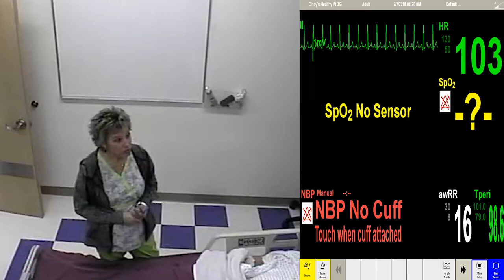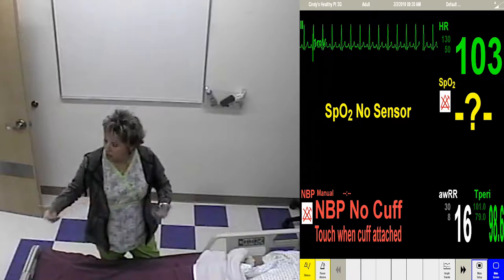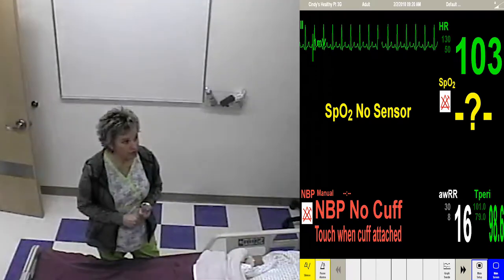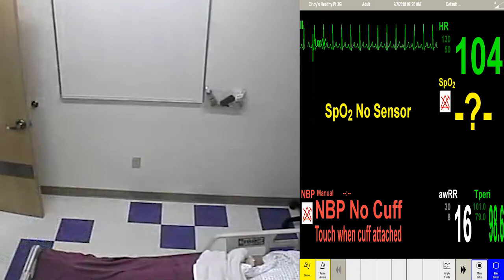A normal heart rate is? 60 to 100. This one is too fast. Our nursing word for too fast heart rate is tachycardia. So this rhythm is? Sinus tachycardia. Very good. And so what are the cool people going to call it? Tachy. Not even sinus, just tachy.